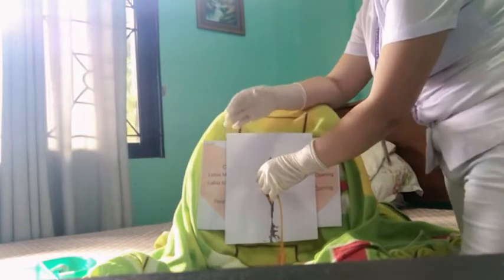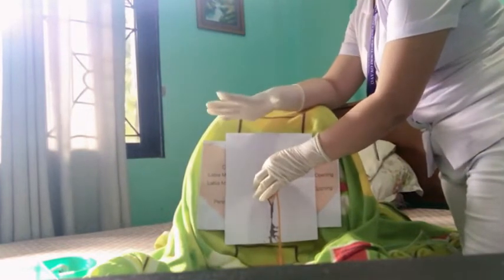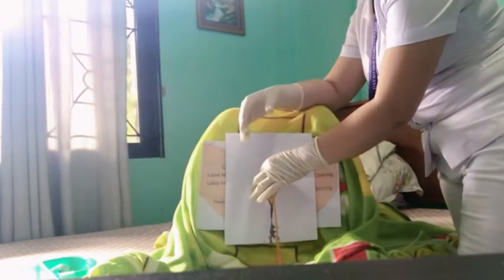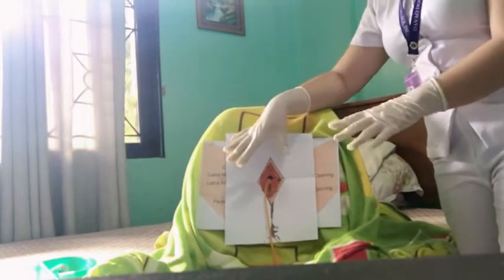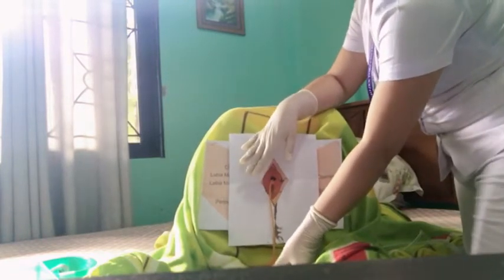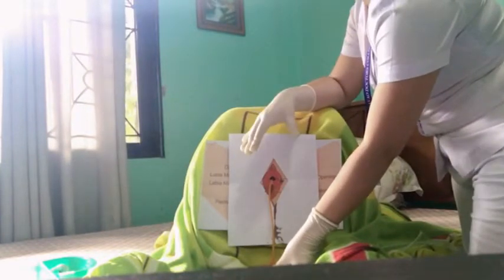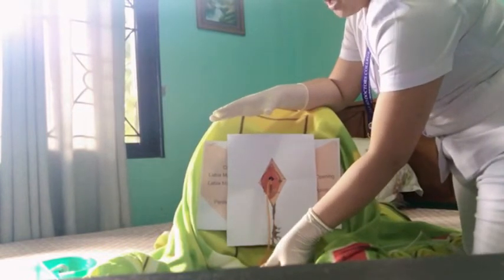If a specimen is to be collected, pinch the catheter with the thumb and the finger while placing the specimen container in position. Urine will flow out of the catheter if the fluid is not occluded. We have our specimen container here. Rest the hand in the pubis area while holding the catheter in place. Withdrawing the catheter and pushing it back will only increase the possibility of contamination to the urethra. So place it gently and correctly.